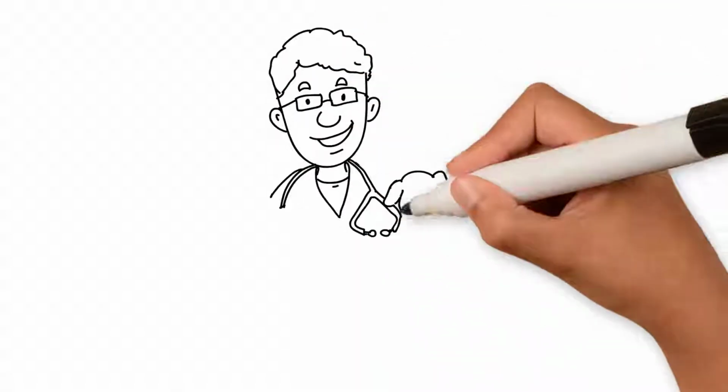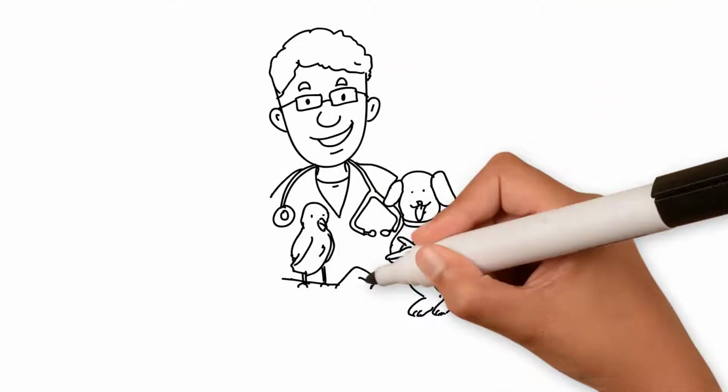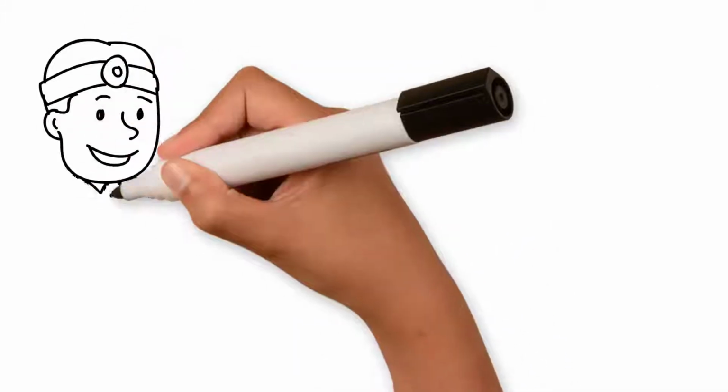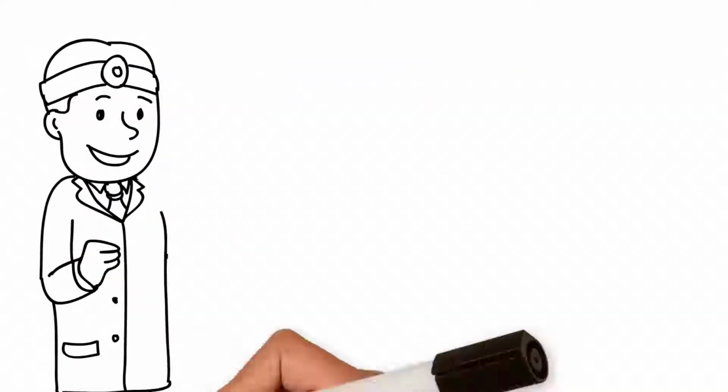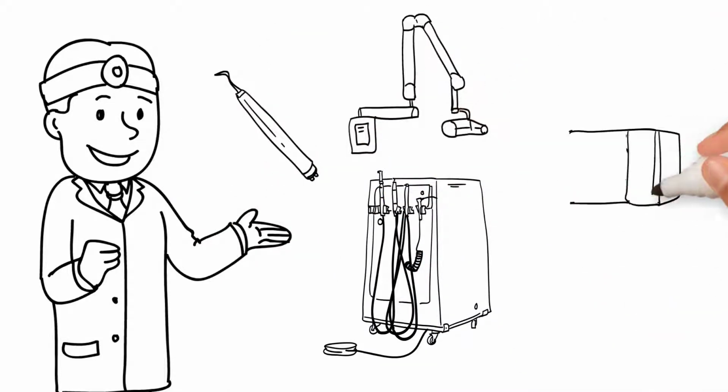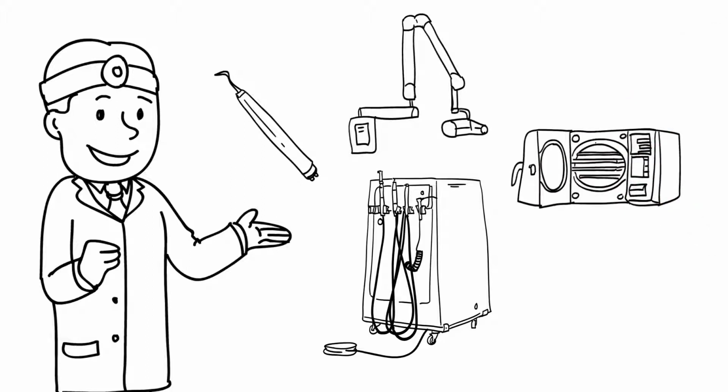According to the American Animal Hospital Association's dental guidelines for dogs and cats, the basic equipment requirements are an air-driven dental unit with high and low-speed handpieces, a powered scaler, an X-ray system, and sterilization equipment.